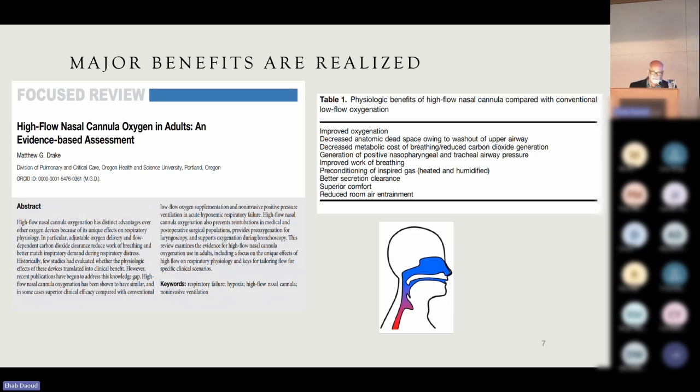That has to do with the breathing rate and the expiratory compliance or elastance of the patient. And the reconditioning of inspired gas also is important. We're putting high flows through. Those high flows that are adequately humidified can result in improved patient compliance, also have been associated with improved mucociliary clearance, or at least the maintenance or homeostasis of mucociliary clearance.